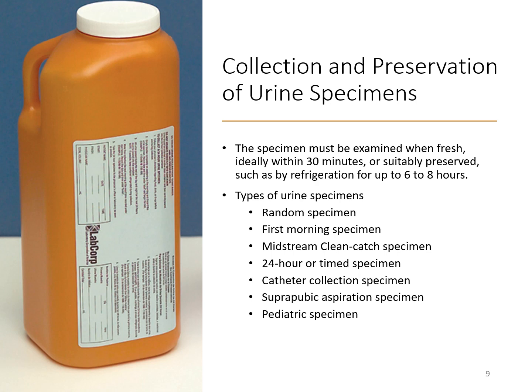Another example would be a 24-hour urine. Specimens like this are typically refrigerated, but there are some analytes that can't be refrigerated, so they may require a certain preservative to prevent those analytes from breaking down.